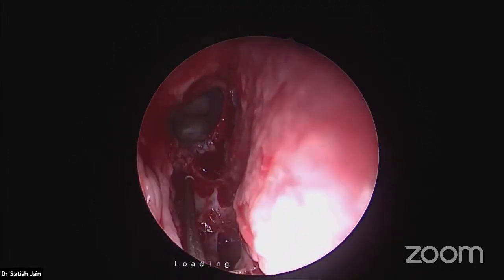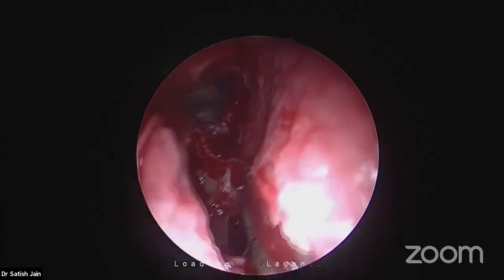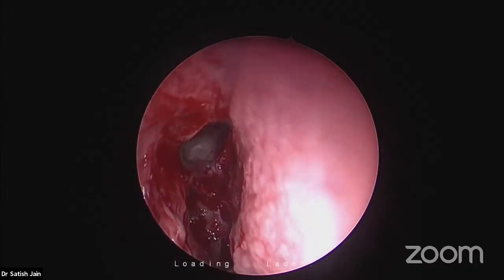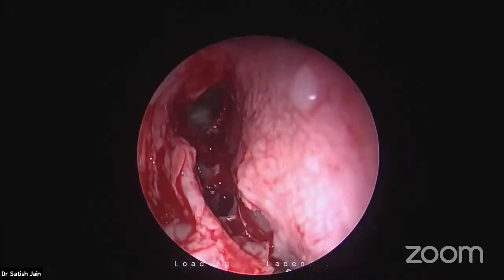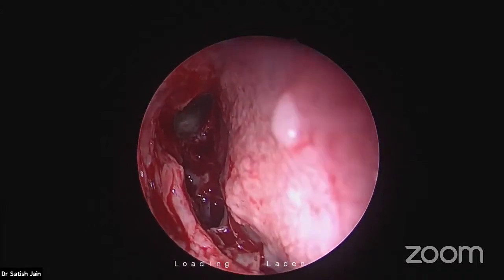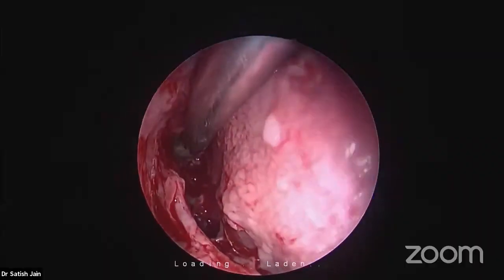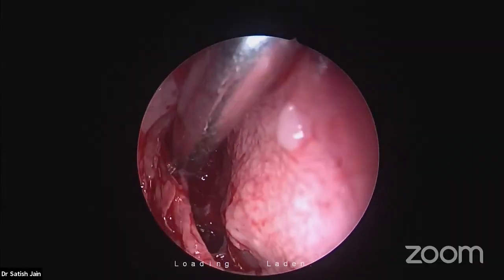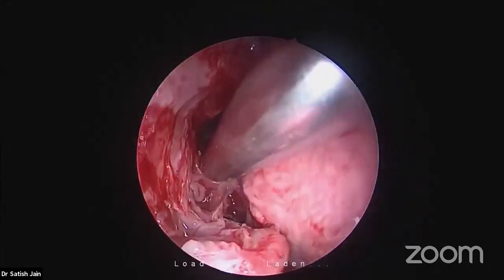See this septa which I have broken. This was the attachment of the bulla and the artery was behind that, protected. And this small recess is the suprabullar recess. What you see above is the roof. I am using the reverse blade here, the so-called adenoid blade, to remove this tip of the bulla, the anterior part of the bulla, to show you something more.